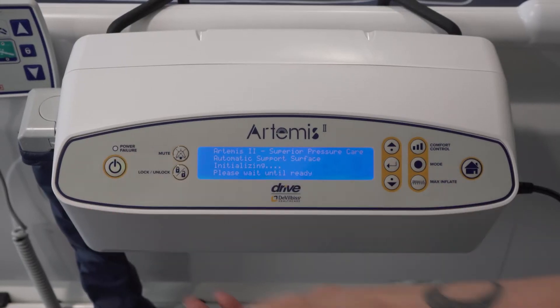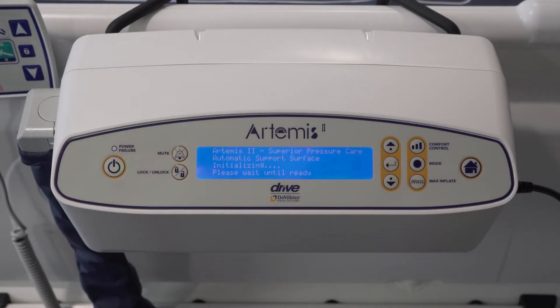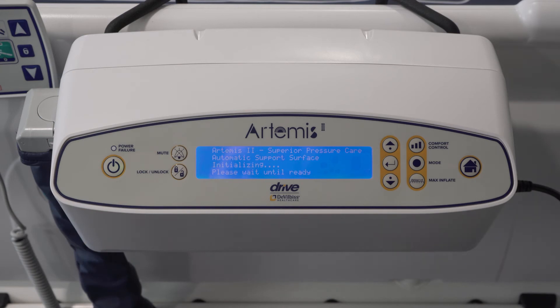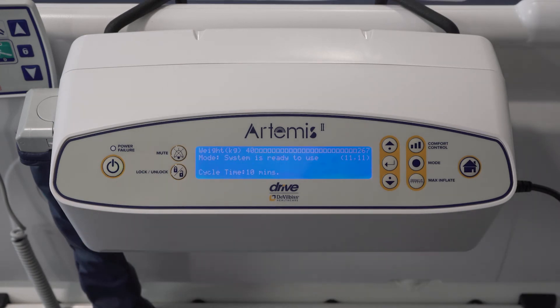The home screen will appear on the digital control system of the pump. Inflation can take up to 45 minutes. The home screen will show 'initialising' then beep when the setup is complete. 'System is ready to use' will be displayed on the home screen. Secure the sheets loosely to ensure they do not interfere with any cell alternation.